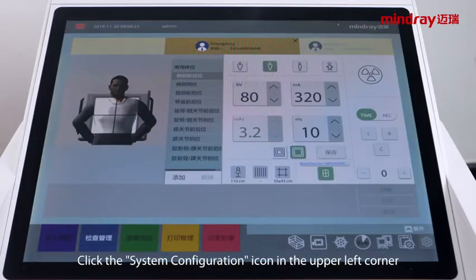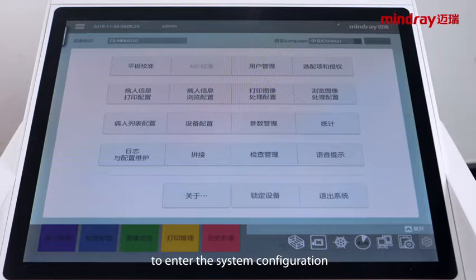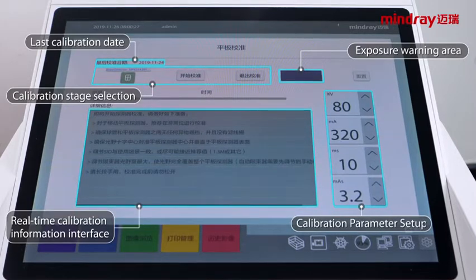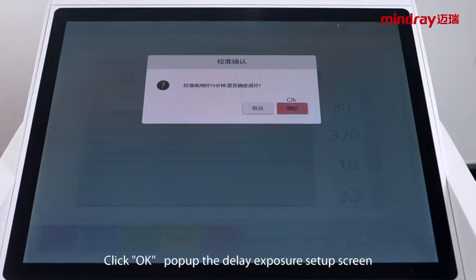Click the system configuration icon in the upper left corner to enter the system configuration. Click detector calibration. Click start calibration. A warning screen will appear — click OK.